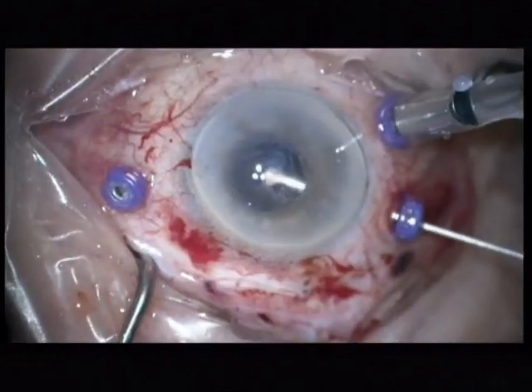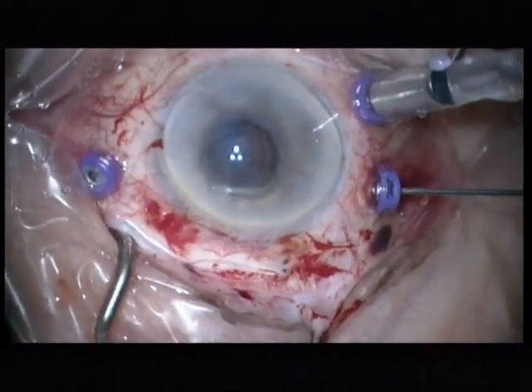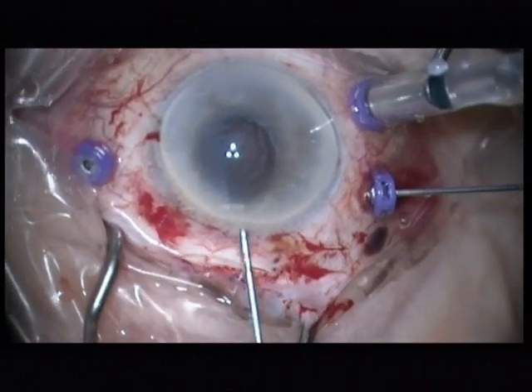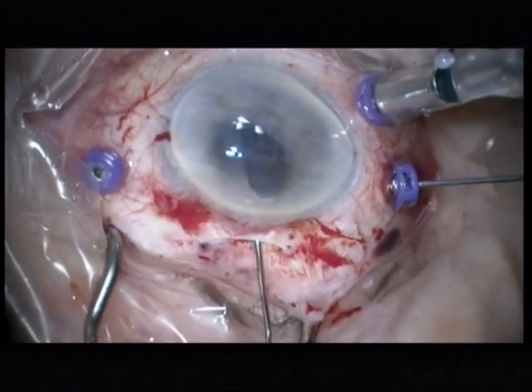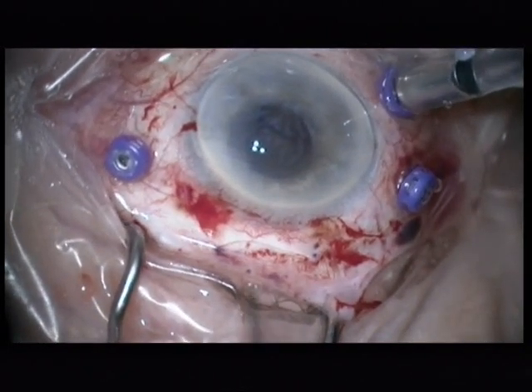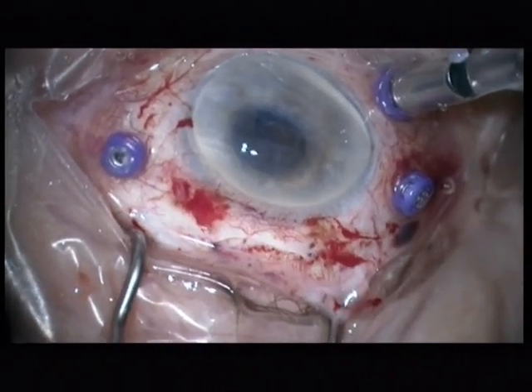Oh, there is some fibrotic part of the lens capsule left. I grab this now with the vitreous cutter through aspiration. This is quite hard, and elevate it again to the pupil. I hold it carefully in the pupillary area, and now I hold it in front of the iris. The left hand has a BSS cannula, and the fibrotic tissue you see coming out now is removed.